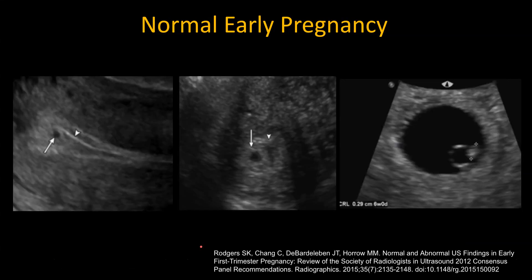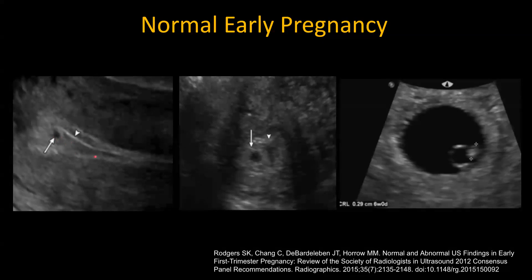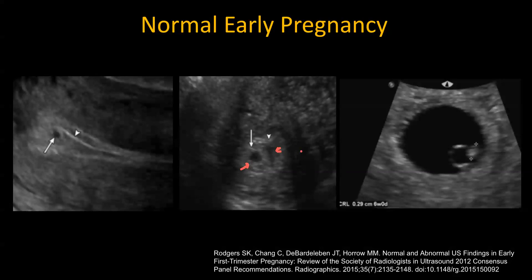For normal early pregnancies, there are a couple of signs that have been described. The intradecidual sign is where you see an eccentrically located gestational sac in the echogenic decidua. The second sign is the double sac sign, consisting of two concentric echogenic rims with a tiny fluid collection of endometrial fluid. The inner ring is the decidua capsularis around the chorion, and the outer ring is the decidua parietalis.